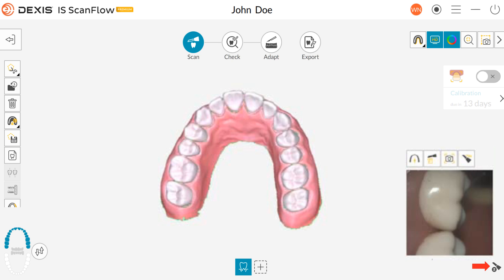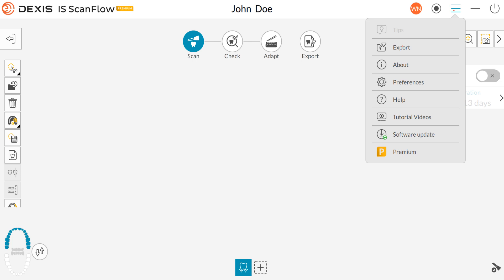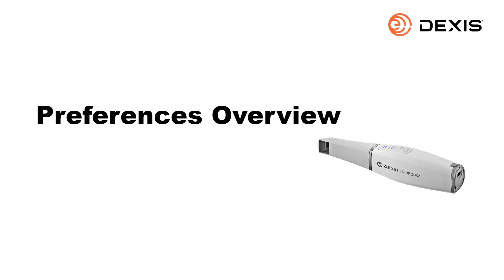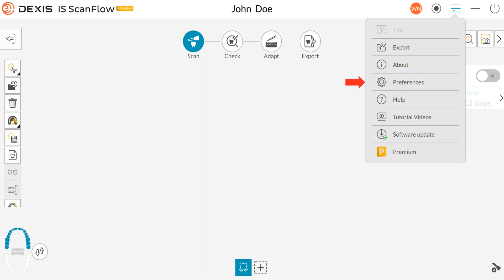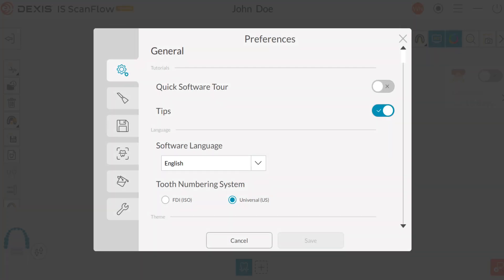Under the settings menu you have the following options: Tips, Export, About, Preferences, Help, Tutorial videos, software update, and premium plan options. To access preferences, click to open the menu and click Preferences. The preferences dialog box enables you to select DEXUS IS ScanFlow interface and scanner settings. It is recommended to set up your preferences before using the scanner. Note: turn on your scanner prior to opening DEXUS IS ScanFlow to have all options available to edit. There are six preference categories: General, Device, Save, Scan, Color, and Tools.